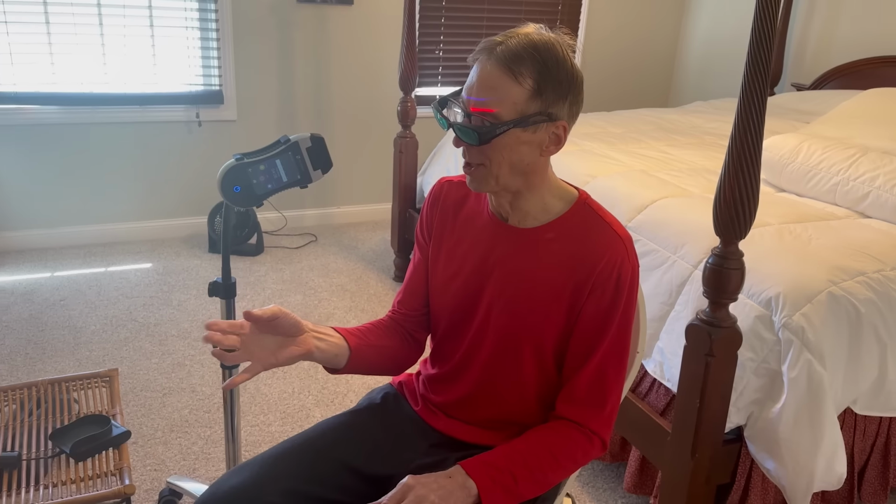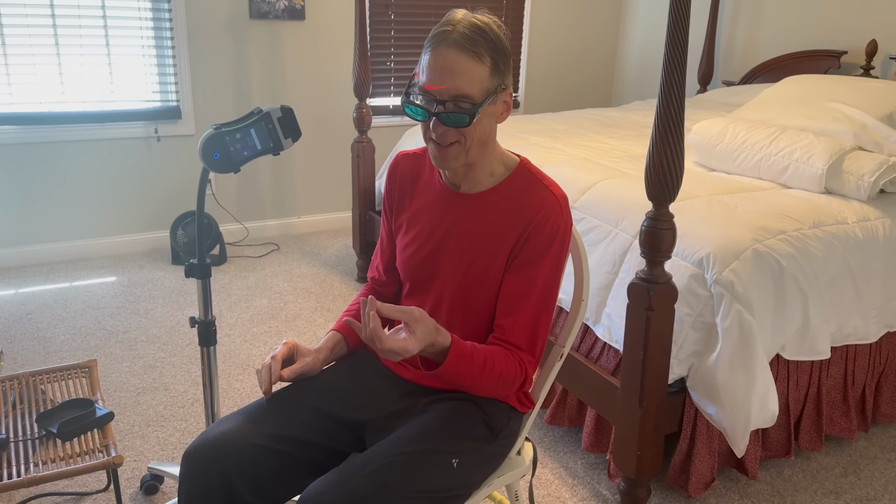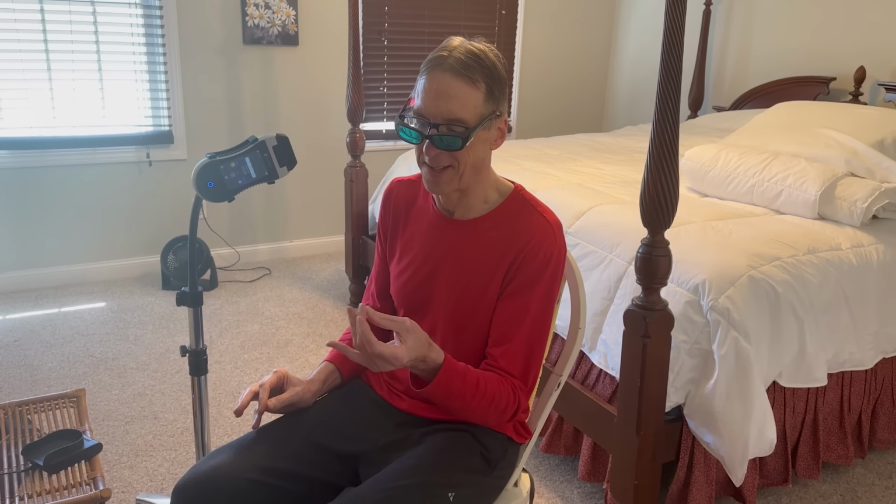Right, so it's a non-invasive, pain-free treatment utilizing specific wavelength of light to stimulate cellular activity and promote natural healing process. In other words, the cold laser goes directly on the skin and it goes in deeply into the skin to help cellular healing at the neural level. So the low-level laser therapy beams can also affect the tissue in the area, enhancing cellular metabolism, reducing inflammation, and accelerating tissue repair. It is commonly used for pain management of sorts, and also if someone has an open wound, sometimes it can help it heal up faster.